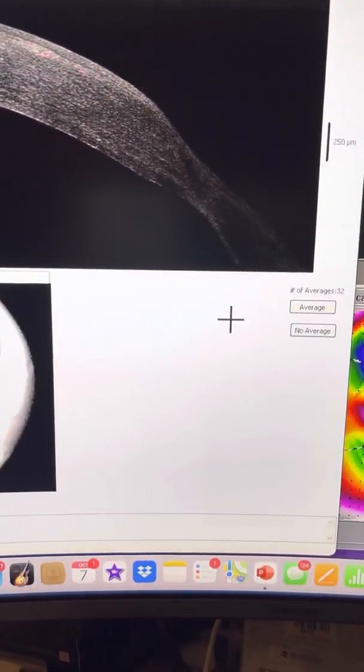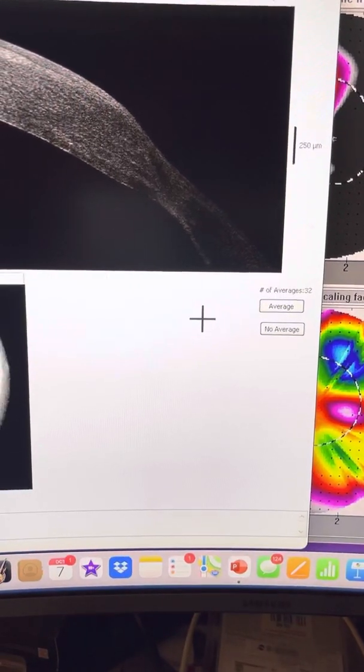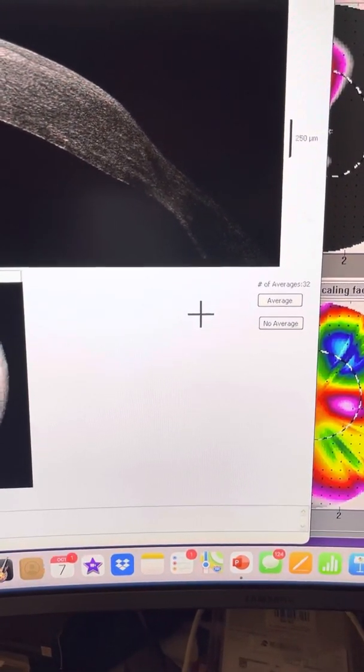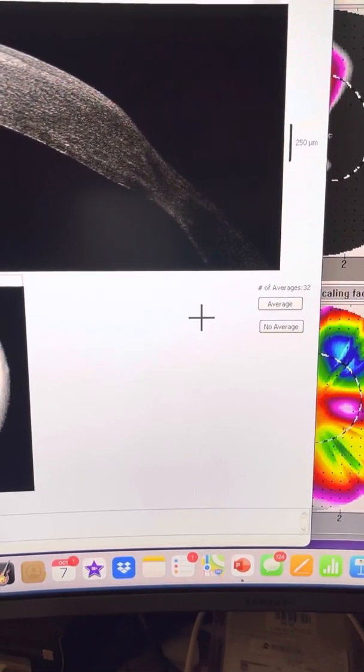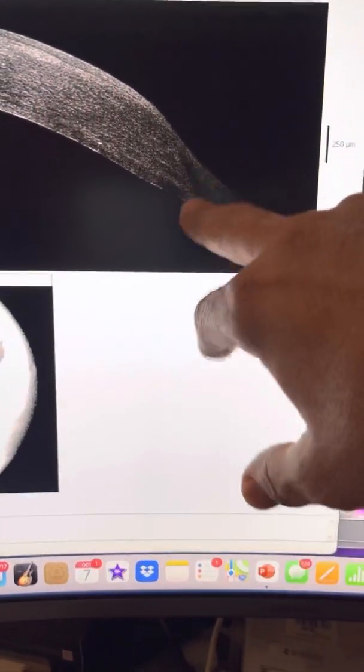Fortunately, most of these fall within the Pentacam maps. Pay attention to the pachymetry maps on the Pentacam and see if in that periphery of the graft, most grafts are eight to eight and a half millimeters. So right at the edge of that pachymetry map, try and seek for any area of significant thinning.